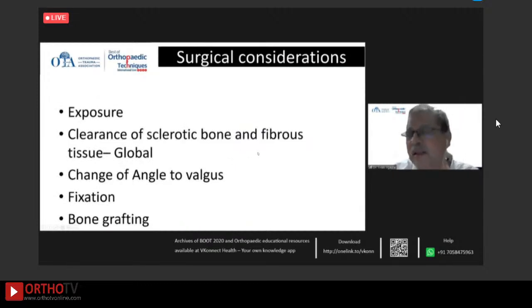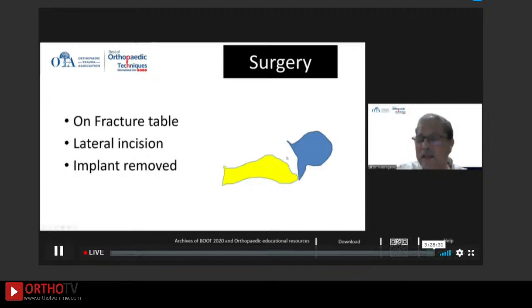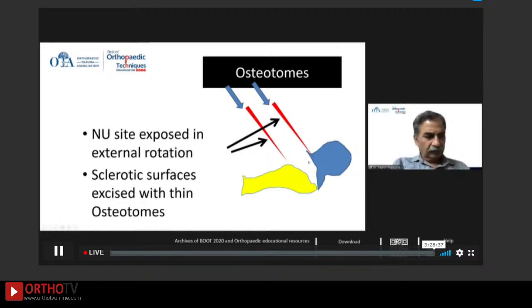So what we proceeded with, you can see we did a lateral exposure on a fracture table. We explored the fracture site or non-union site, removed the implants, and then used two thin osteotomes to excise. Rather than going at the fracture site, we used two thin osteotomes and just excised the sclerotic bone with the fibrous tissue in toto.